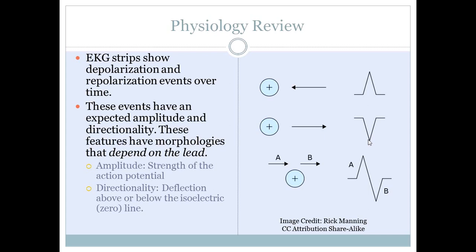Alright, so starting off, we're going to go for a little physiology review, just to describe EKGs in a nutshell. An EKG measures changes in voltage across 2 points. Those 2 points are electrodes that are placed either on the skin of the patient, or there are some leads that have electrodes that theoretically originate in the heart, the electrically active centers of the heart, and then there are electrodes that pick up the change in voltage from the heart to the skin.